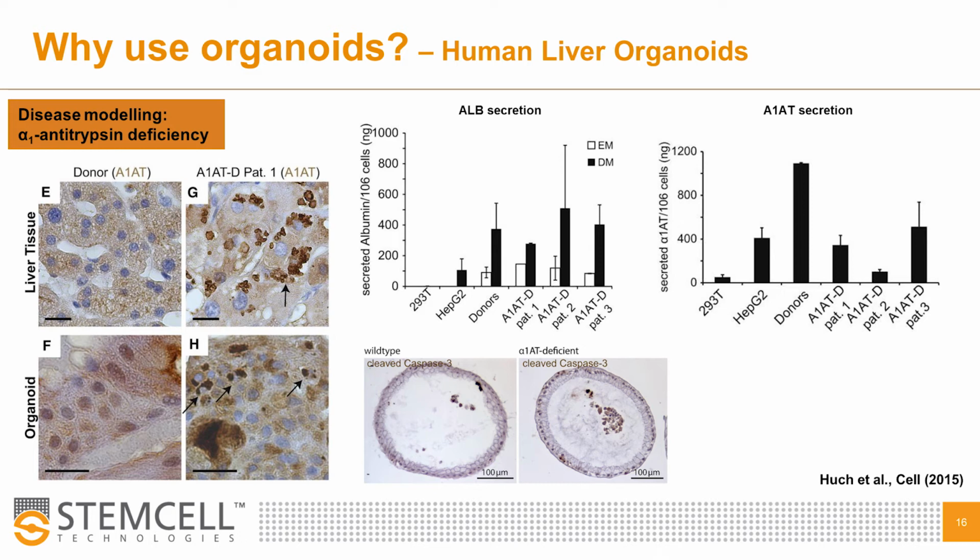Overall, the groundbreaking aspect of this publication was that within 3 to 4 weeks, inherited liver disorders were phenocopied in patient-derived organoids. Previously, studies had to rely on first the reprogramming of a patient's somatic cell into induced pluripotent stem cells, and then their subsequent differentiation to hepatocyte-like cells, an undertaking that's a matter of months rather than weeks.